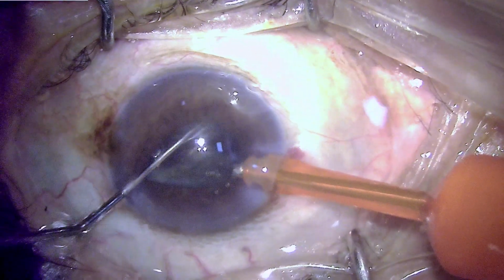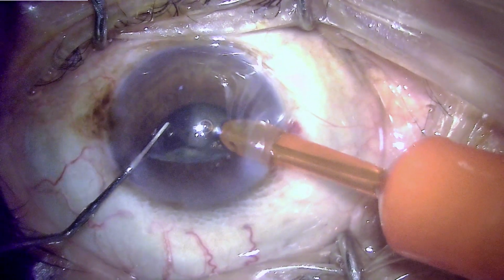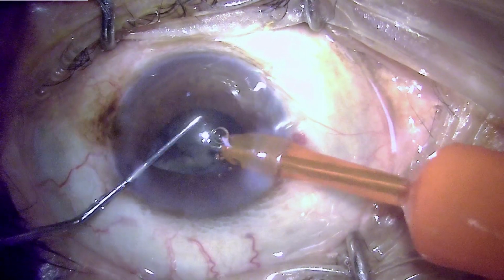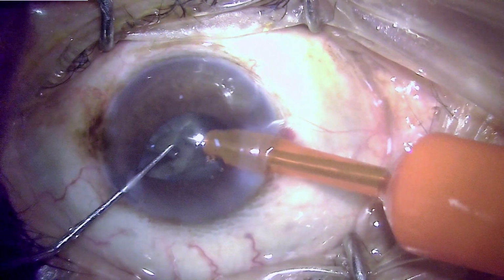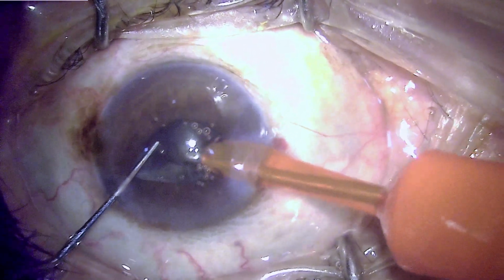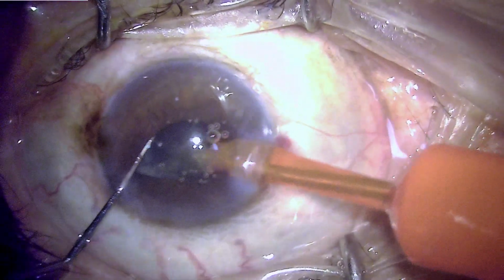Here we can see the nucleus is consistently being hidden behind the iris, and the side port instrument is more active compared to the main port instrument, that is the phacoemulsification tip, in manipulating the pieces so that they are aligned to the phaco tip and emulsified.